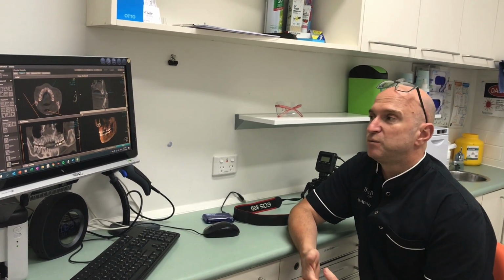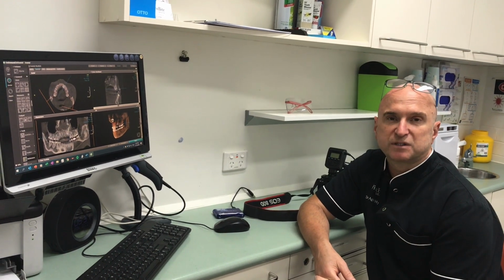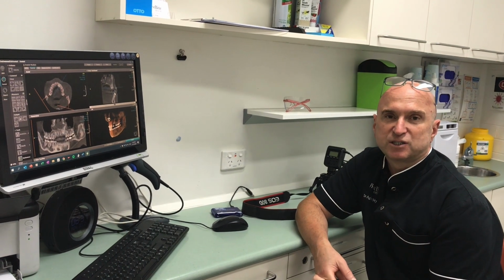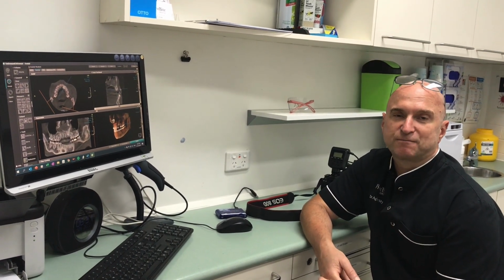And we charge for the x-rays. We don't give it as part of the orthodontic package. It's a separate fee. Yep. Just like the surgery is a separate fee.